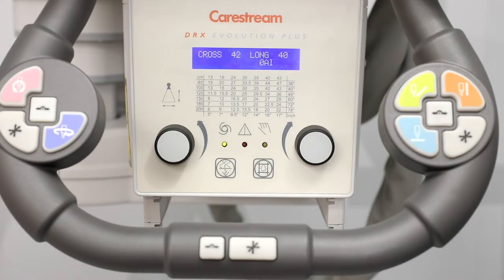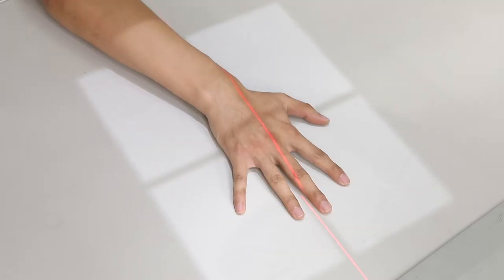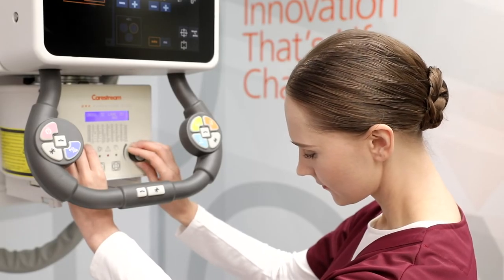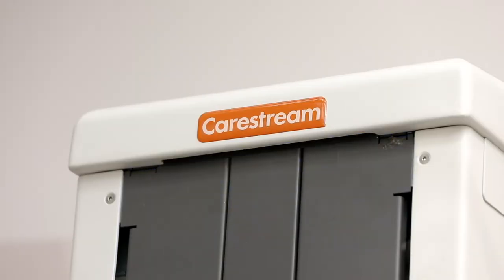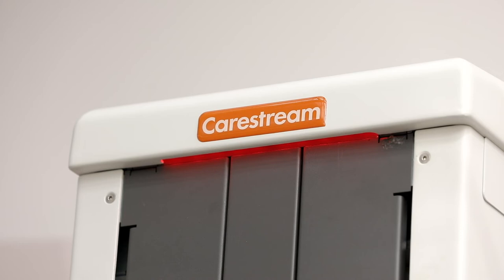Evolution Plus has improved collimator control through the use of asymmetric collimation, where the top and bottom blades move independently of each other, allowing the radiographer to fine-tune collimation when the body part is not centered on the detector. Functional lighting has been added to both the overhead tube and wall stand, and is consistent throughout all CareStream products.